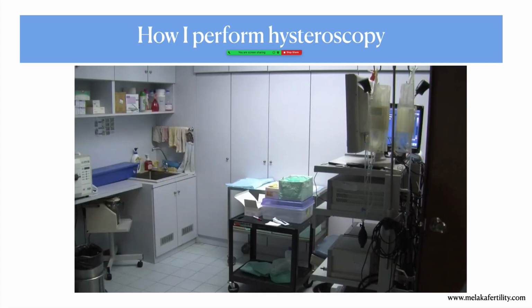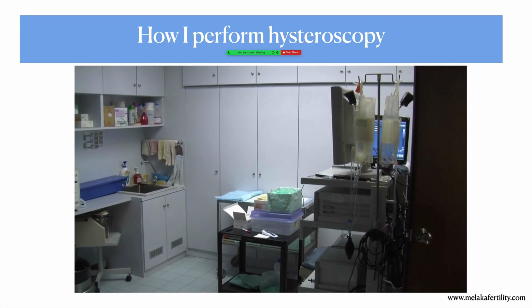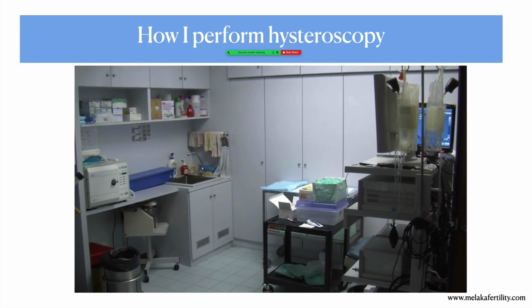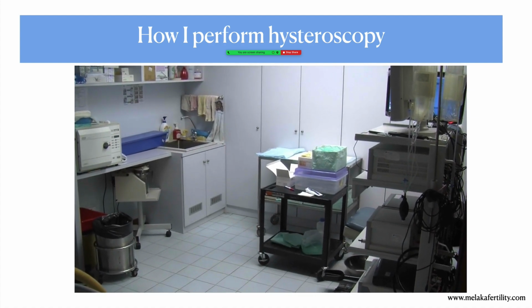Now, this is a short video that I took several years ago just to give you an idea of my office setup and how the procedure is done. While I'm seeing patients, my nurses will be preparing all these instruments, and this is how my clinic is on the other side. On this side is the ultrasound machine, and this is the other side.